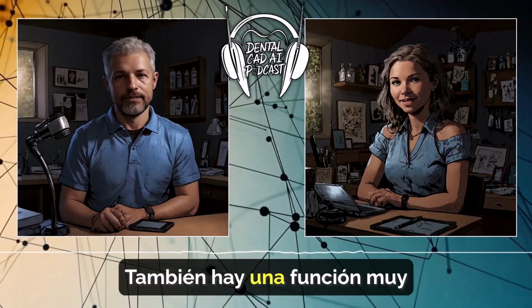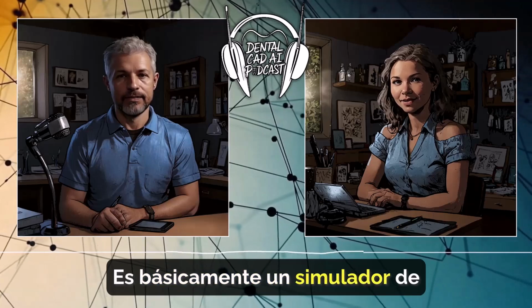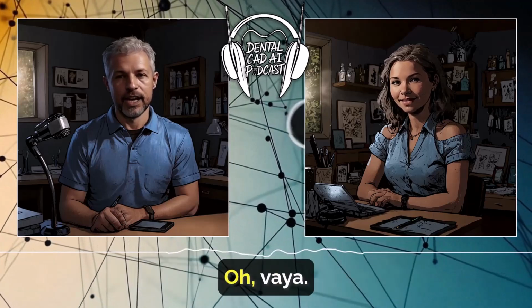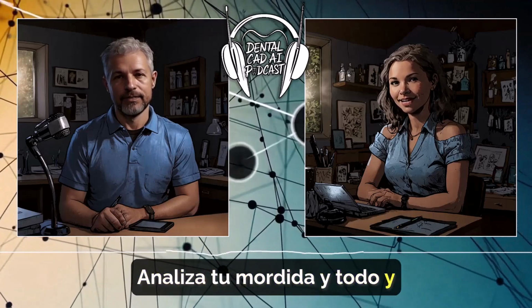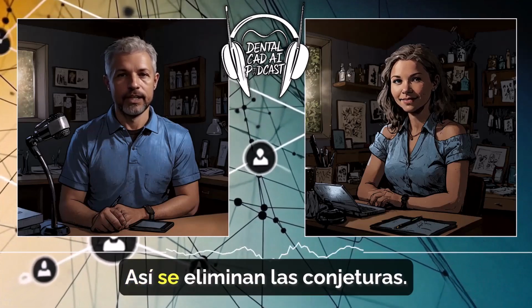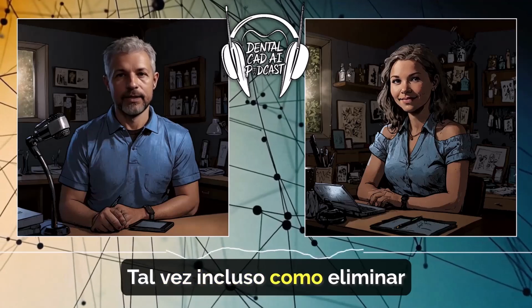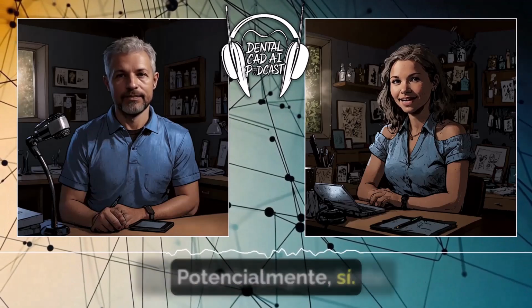There's also this really cool feature called the Auto Articulator. It's basically a virtual jaw simulator. Think of it like that. Oh, wow. It analyzes your bite and everything and helps design restorations that actually fit and function perfectly. So it takes the guesswork out of it. Pretty much, yeah. And it could potentially cut down on your chair time significantly, maybe even eliminating a whole visit. Potentially. Yeah, it's pretty amazing.